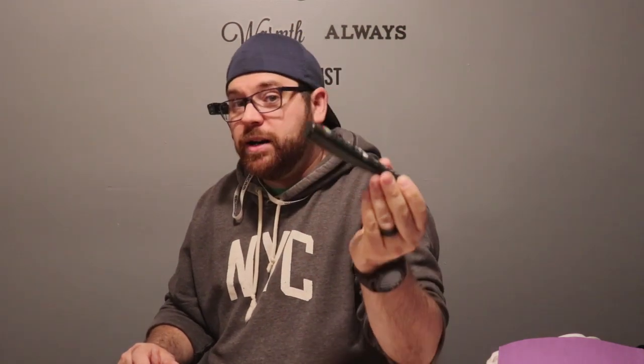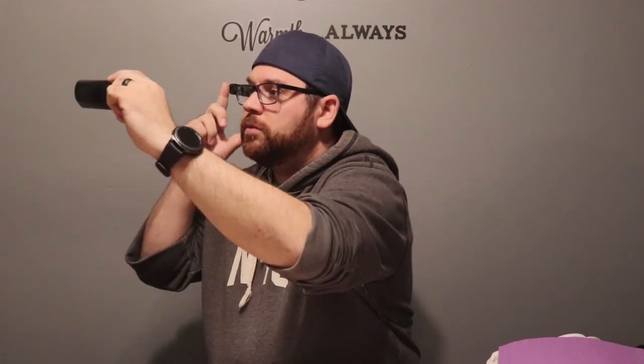You're going to hear beeping, and then it's going to say ready for product learning. And then the best part is the ORCAM is going to tell you itself what to do next. All the steps will be there for you. So I'm going to place my remote control in front of me. This is not entered into my ORCAM, but we're going to see together if it will do the job it's supposed to. So we're going to do it, and then we're going to listen to the directions it tells me.